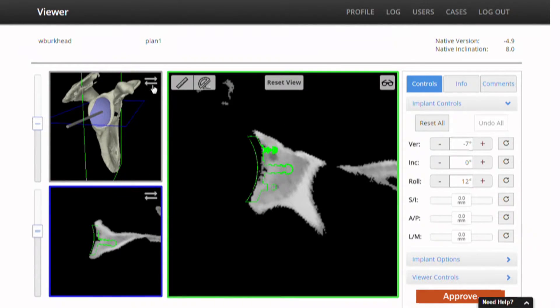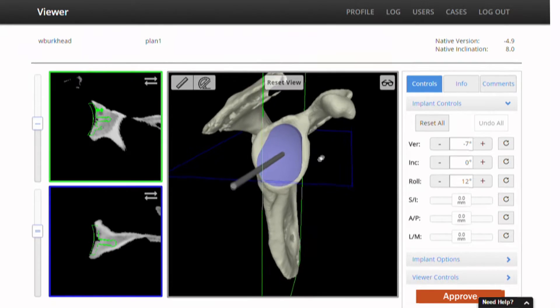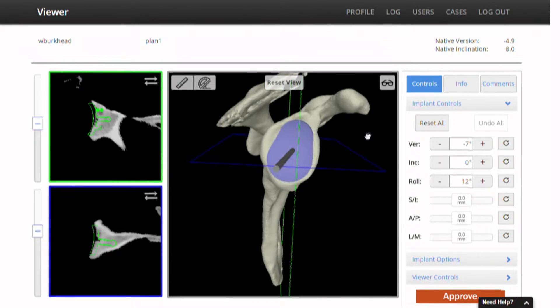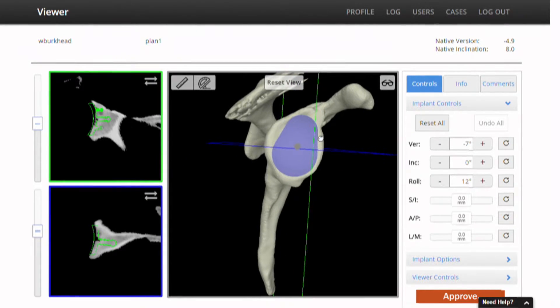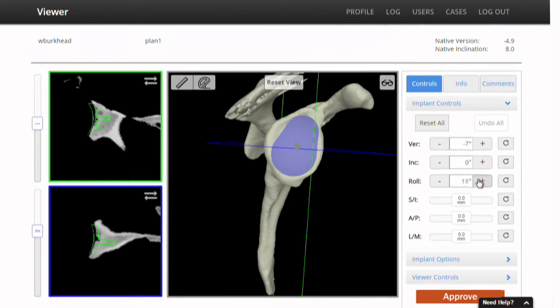Roll is this kind of axial motion, and you can see looking here on the sagittal view, the top of the glenoid should be at the very base of the coracoid, so I'm going to roll this around a little bit to line that up.